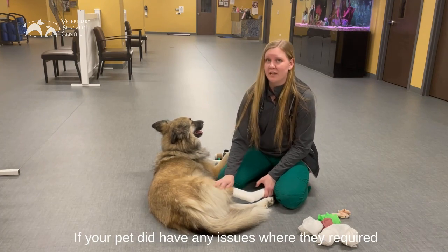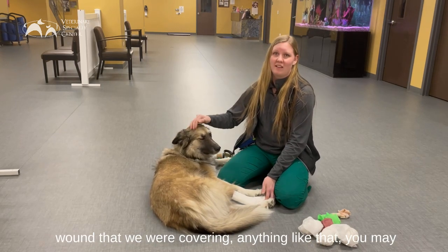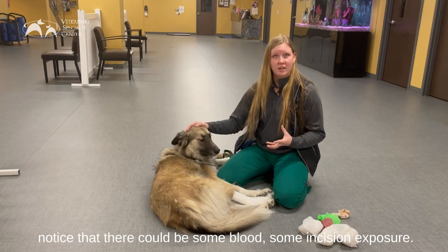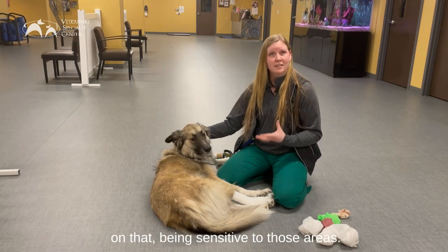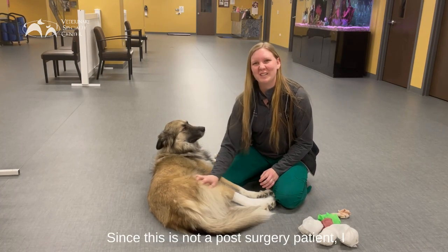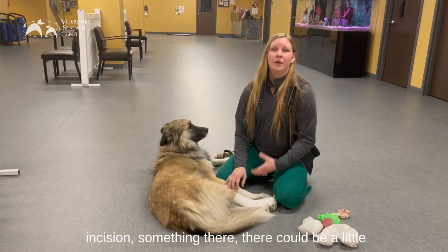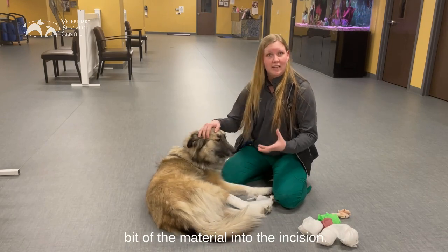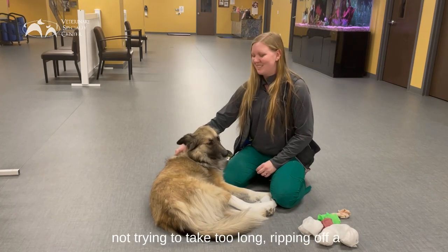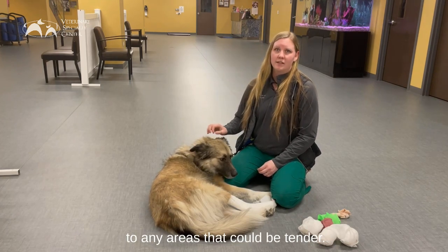If your pet had any issues where they required an incision to be made surgically, if they had a wound that we were covering, you may notice that there could be some blood or incision exposure. Make sure we're keeping an eye on that and being sensitive to those areas. Since this is not a post-surgery patient, I don't have to be as careful. But if you do know there is an incision, there could be a little bit of material adhered to it. Try to be as gentle as possible removing those — not dragging out the process, but being very sensitive to any areas that could be tender.